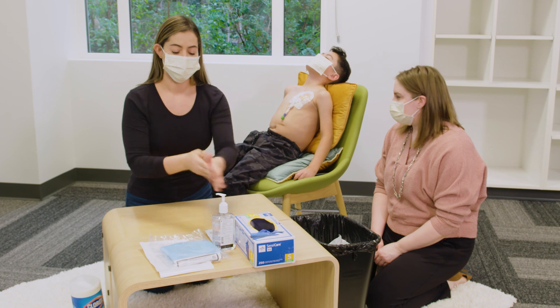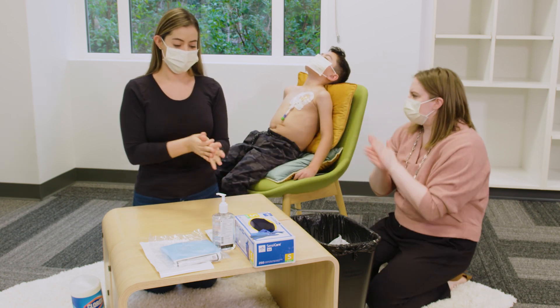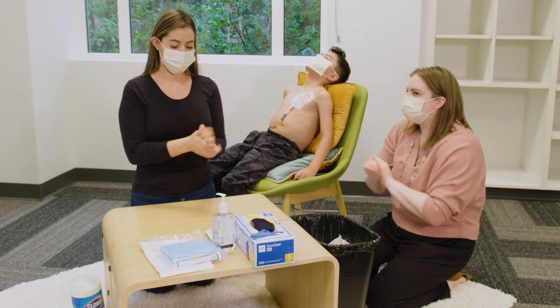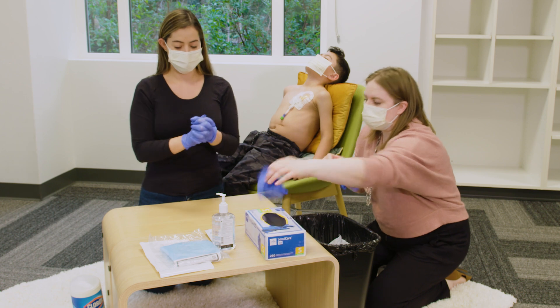To protect from any germs, both you and your child should wear a mask. Then use hand sanitizer and put on clean gloves. Any helper should wash hands, wear gloves, and a mask too.